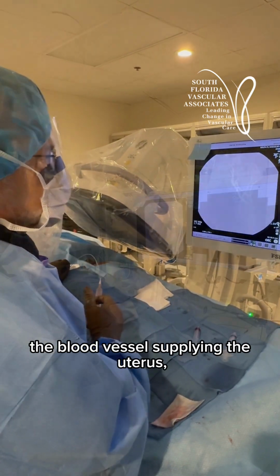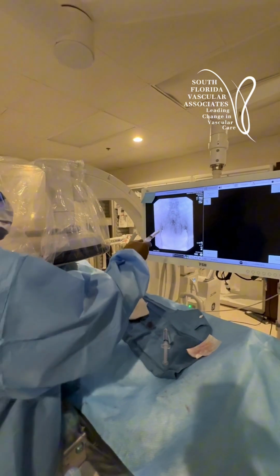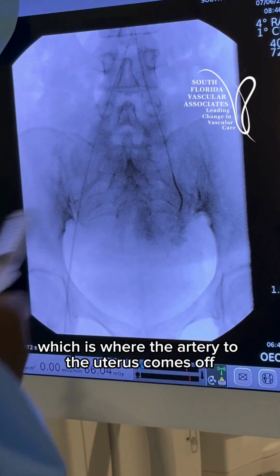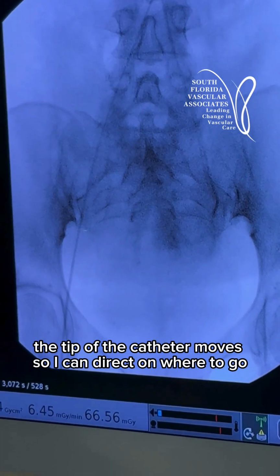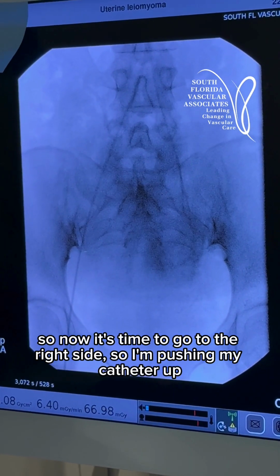supplying the uterus. Okay, so this syringe is attached to my catheter, which the tip is in the left internal iliac, which is where the artery to the uterus comes off. And you can see that when I turn my catheter, the tip of the catheter moves, so I can direct on where to go. So we're done embolizing the left, so now it's time to go to the right side.